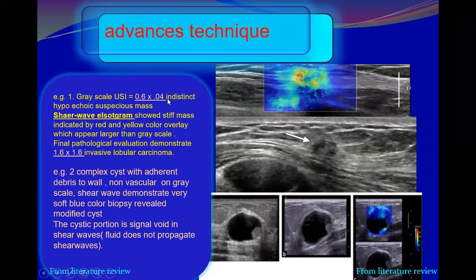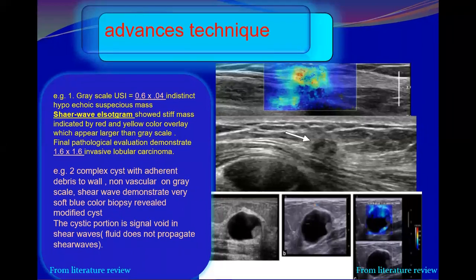Okay, look for the lesions in the grayscale and in the biopsy result, following more with the elastography. And as we mentioned, your case, the complex cyst, is definitely borderline. This is BI-RADS 4A. So here the shear wave elastography is helping us in downgrading the lesions.